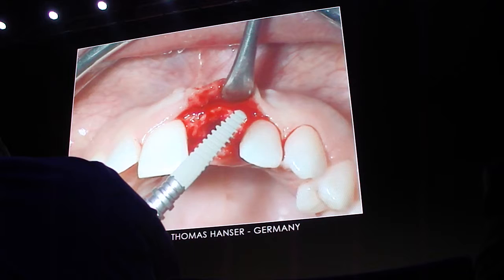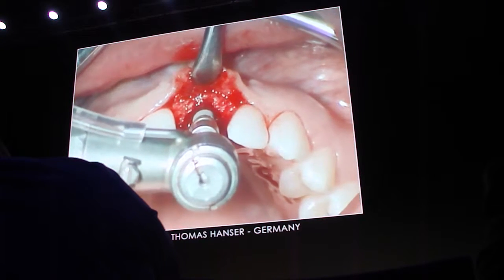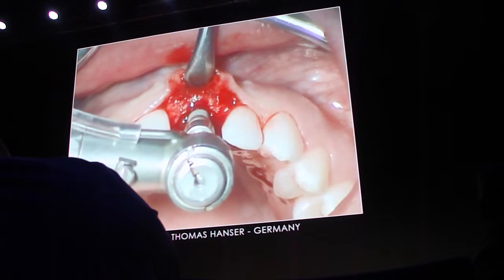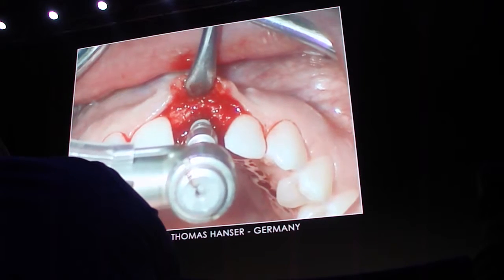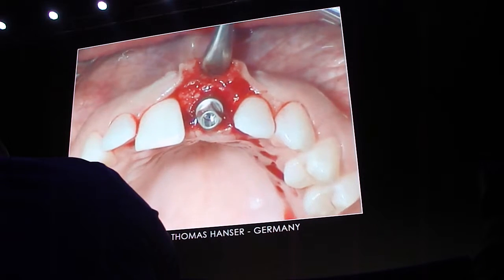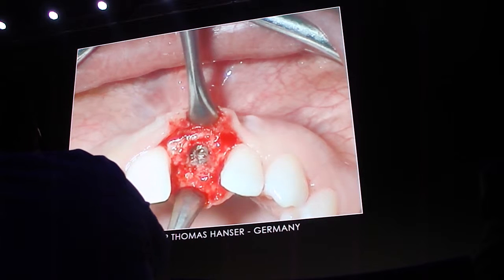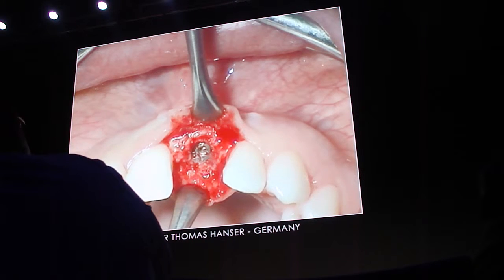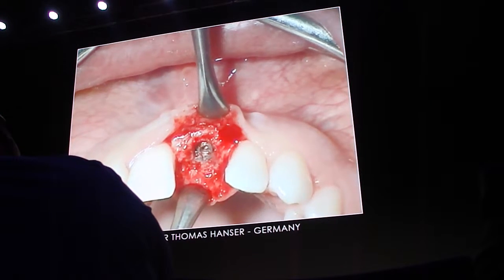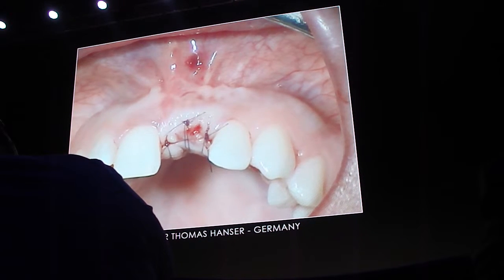And we do have enough bone supporting the implant and the soft tissue. Those days we were using a 3.5 diameter Ankylos, 14 millimeter in length. Of course, today we would maybe reduce the length of the implant. But what we have now is an implant being beautifully surrounded by a revitalized bone situation, enough support for the soft tissue to make this a long-term aesthetic success.